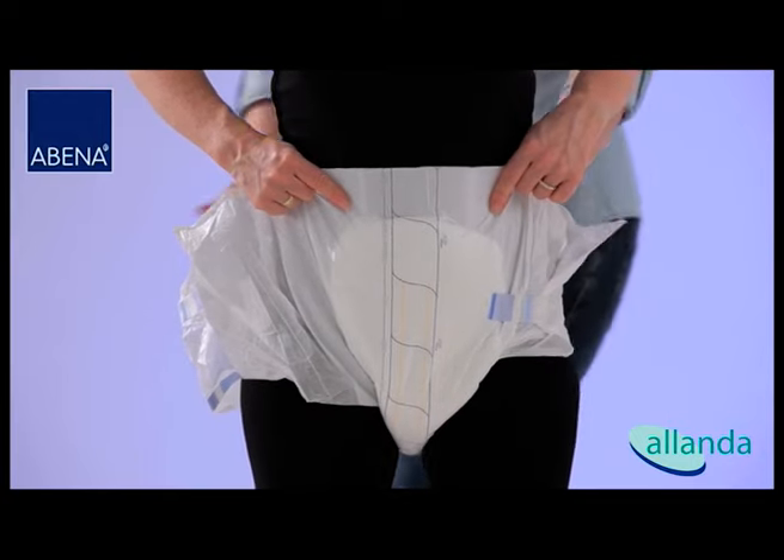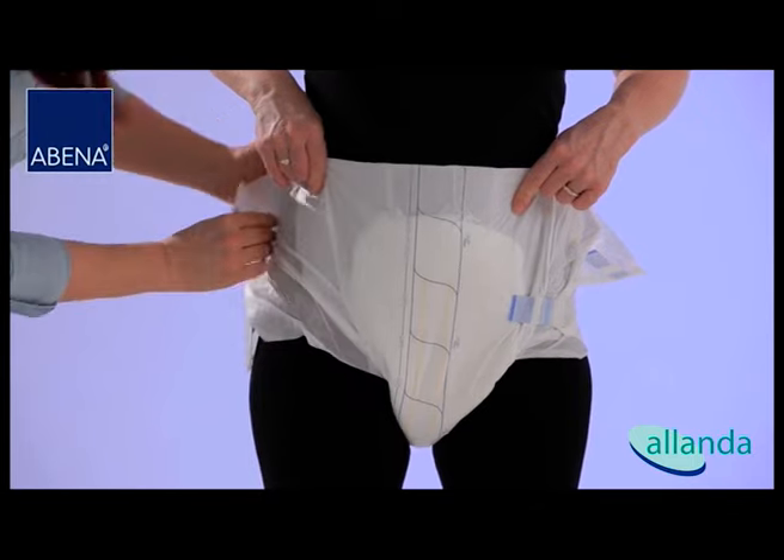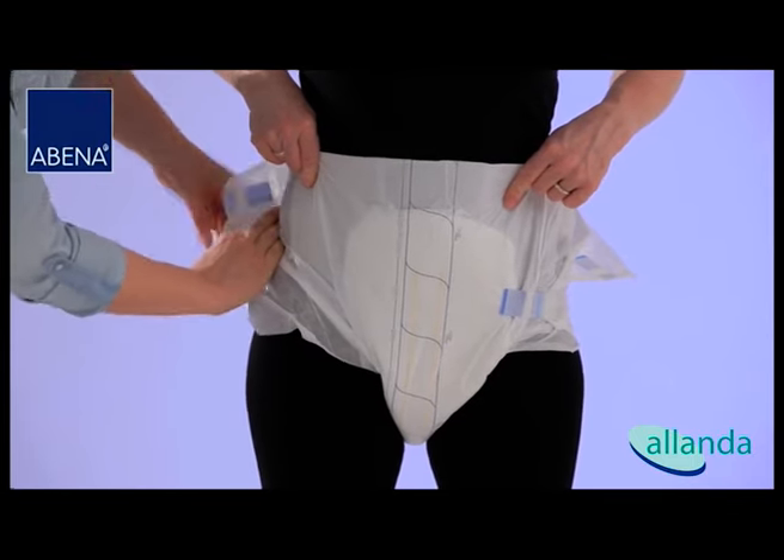Attach the lower tapes on both sides. The elastic zones of the tape guarantee a good and individual fit with a large motion range around the legs.